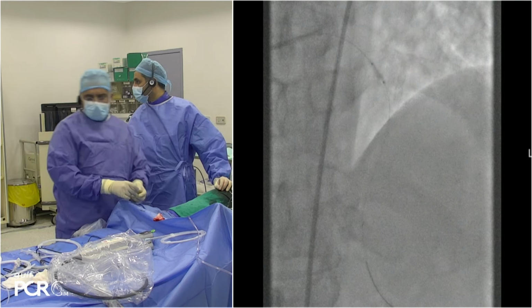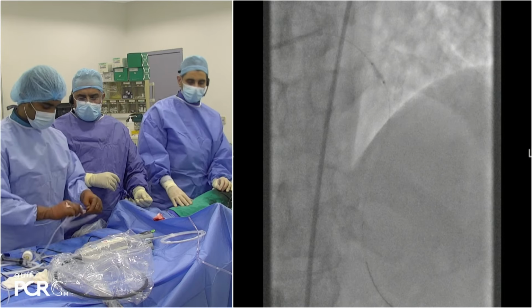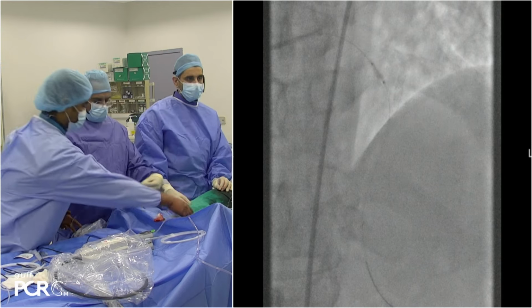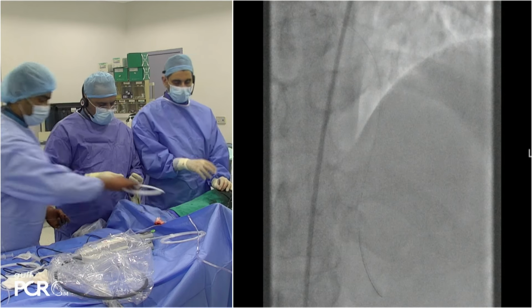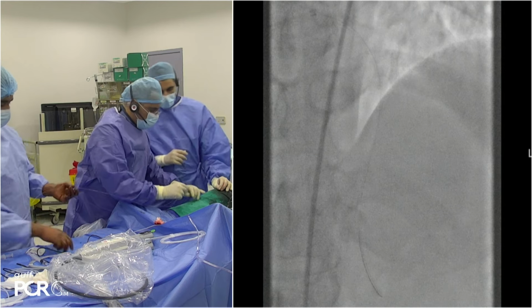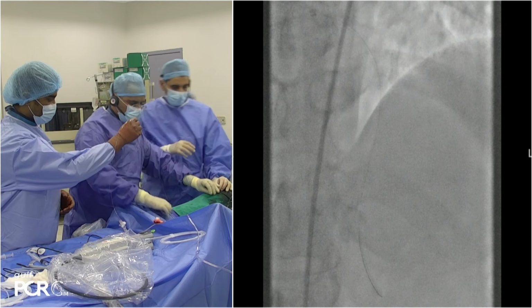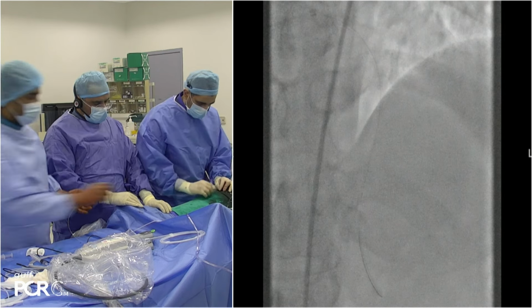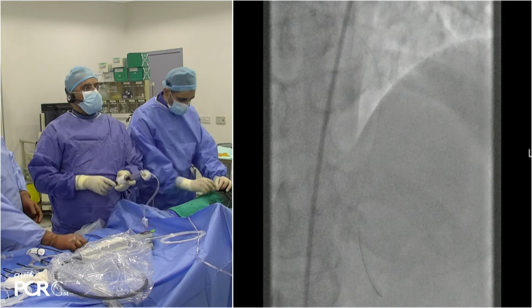Part of the reason for the haziness is the eccentricity of the lesion, not necessarily just the nodule itself. The eccentricity is causing that haziness, and that did not go away with just a run of rotablation or orbital or the cutting balloon yet. I don't know, Dr. Arif, would you tackle the nodule differently, and do OCT after the orbital, or just finish the case and then do OCT?